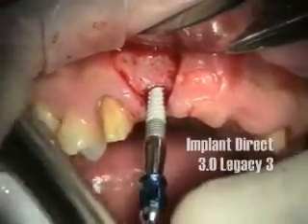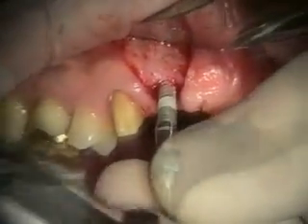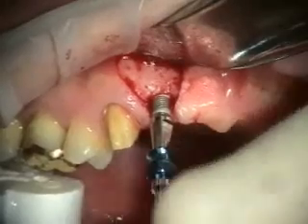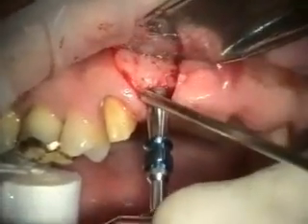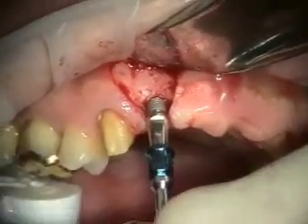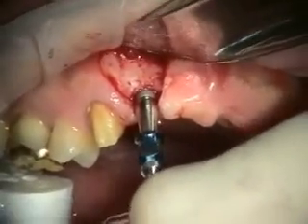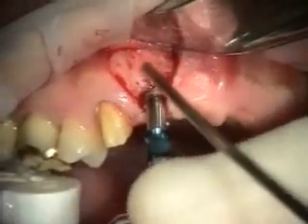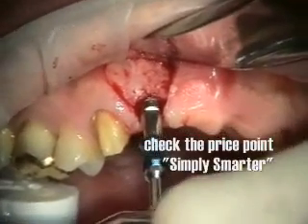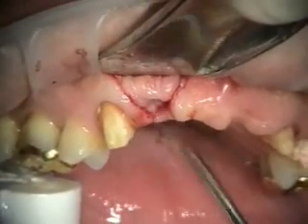We're doing a 3.0. This is an Implant Direct 3.0, and you can see that it's HA coated. It's got two different kinds of threads — a large and a small thread pattern — and it's self-tapping, so it goes in while also expanding the bone at the same time. It also has its own abutment and impression coping.